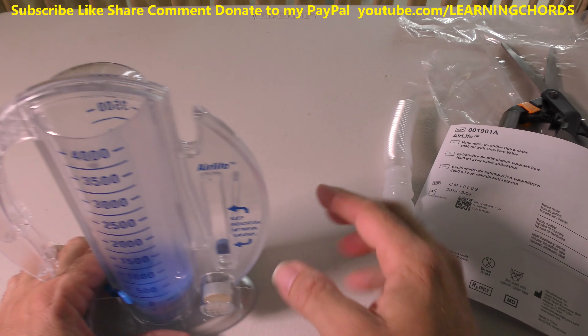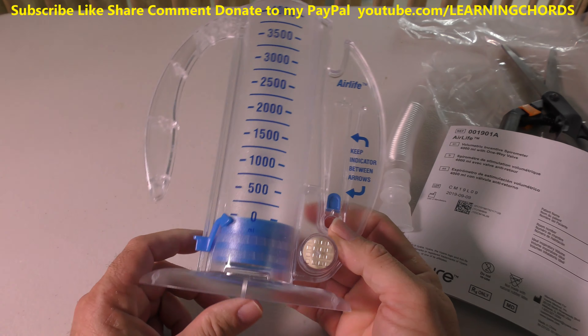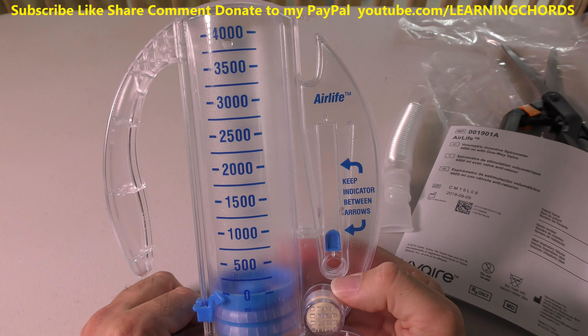This video is going to be on a spirometer — a spirometer. This is a breathing thing, like an exerciser for your lungs.